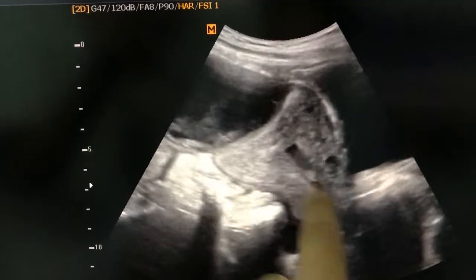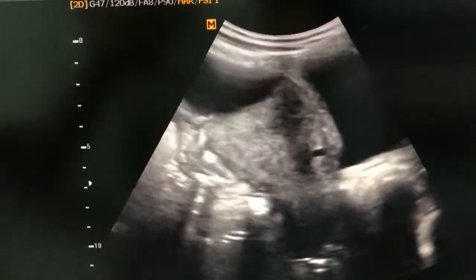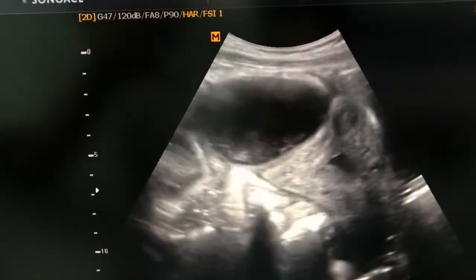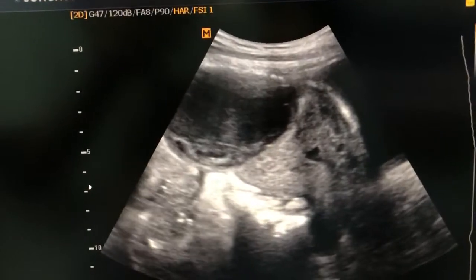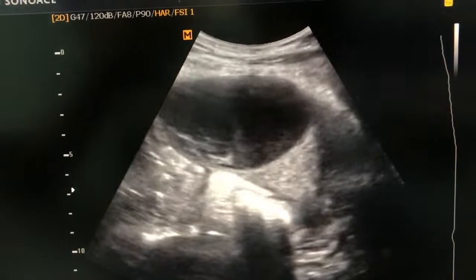This is the uterus, mild fluid. The patient delivered the baby just 5-6 days before only, or maybe 10 days, I don't know exactly, but it is a recent case of delivery. It is not our concern in this video.